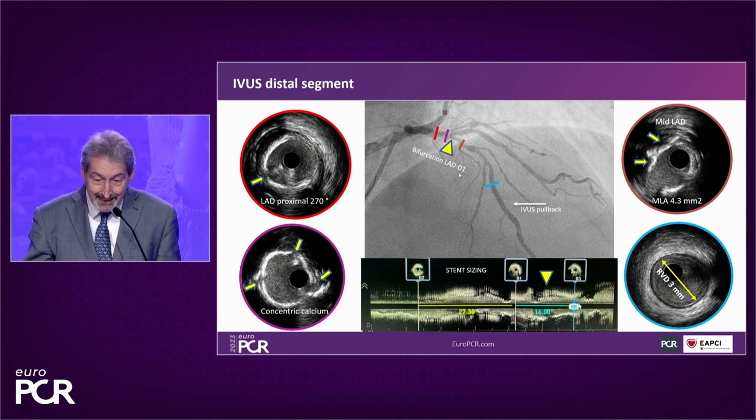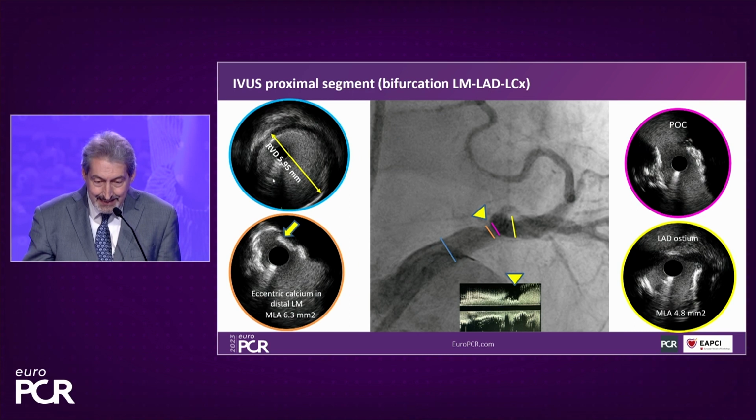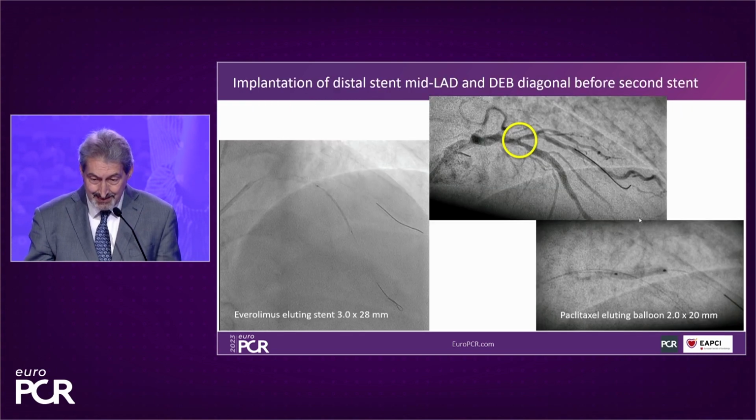That's what we did. But then there is the left main area. And here, of course, we didn't apply much lithotripsy. There is a single small fracture. There is enough calcium, both in the polygon of confluence and at the very origin of the LAD, that's the circumflex opposite to the origin of the circ, in my view, to justify more application of shockwave. Proximal is a very large 6 millimeter vessel. So you have all the information you need to plan your procedure.